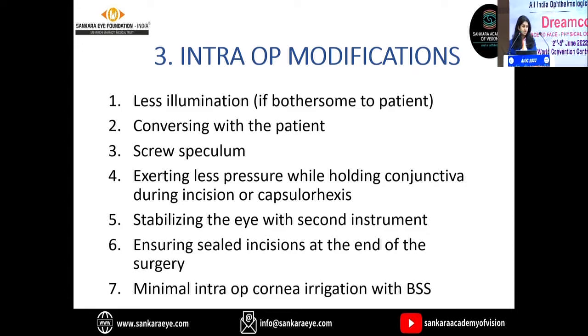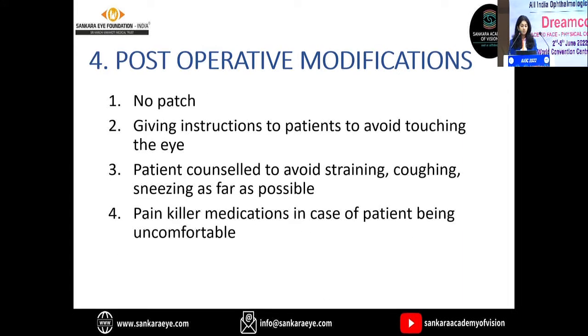We have to ensure sealed incisions because now there's no patch on the eye, which aids in sealing the incisions. And our assistant is used to irrigating the cornea intraop, so that also sometimes can cause irritation to the patient. That maybe can be minimized and we can put a viscoelastic on the cornea. And post-operatively, again, no patch. The patient will keep on feeling the irritation and watering, so he might go and rub the eyes.